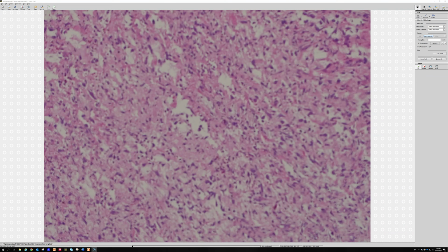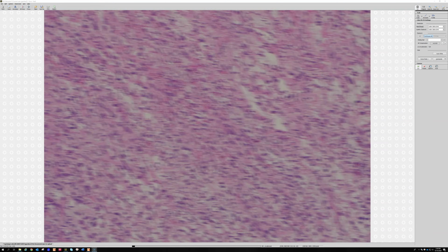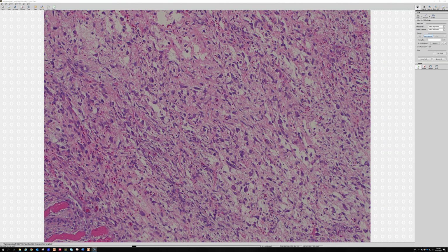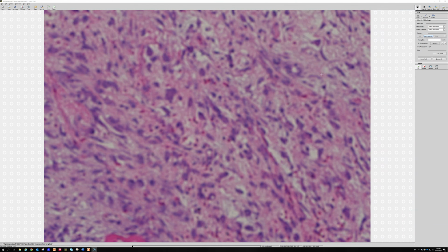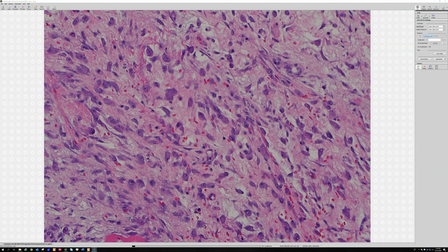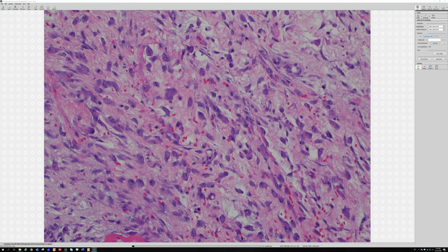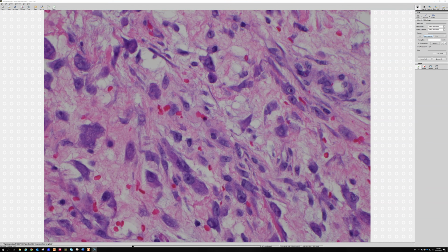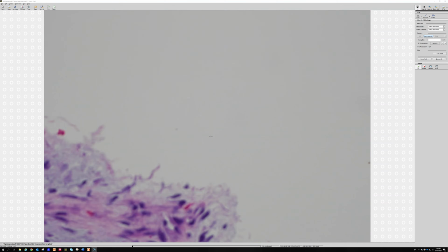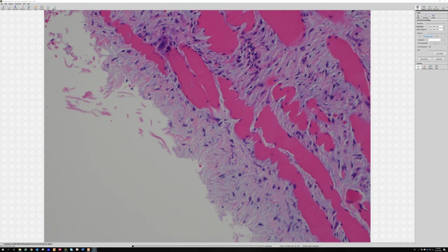I think I know what you're talking about, like in these areas. So here, in the midst of the skeletal muscle cells, in the background here, we've got these cells that have abundant eosinophilic to purple amphophilic cytoplasm, large round nuclei, and big central nucleoli. And they do have kind of a rhabdoid appearance, which is scary, right? And if we look around, there probably are mitoses in here.